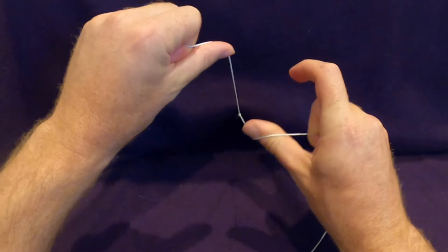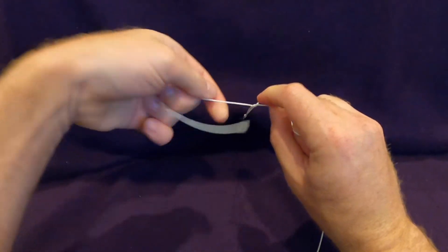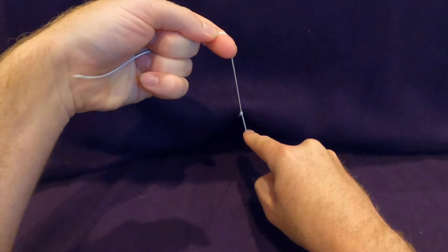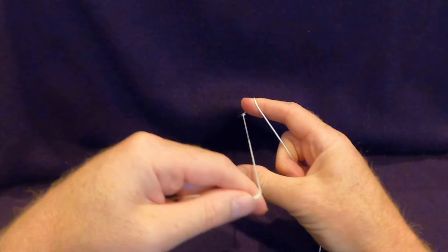The second half of the knot begins by once again making a C with the thumb and index finger and draping the suture behind the thumb. The suture tail passes between the thumb and index finger, they rotate, pinch closed, pass the tail through and then cinch the knot down.